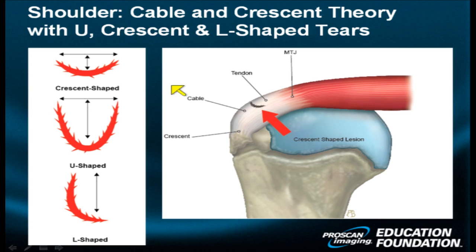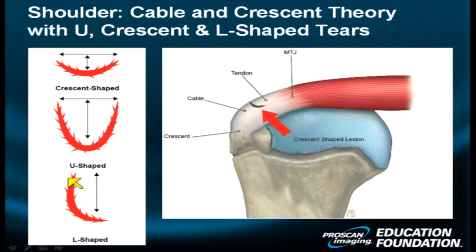Occasionally the tear will only affect one part of the cuff — either the far anterior or the far posterior part. When you look from the top down, the shape of the tear will appear as an L or as a reverse L.